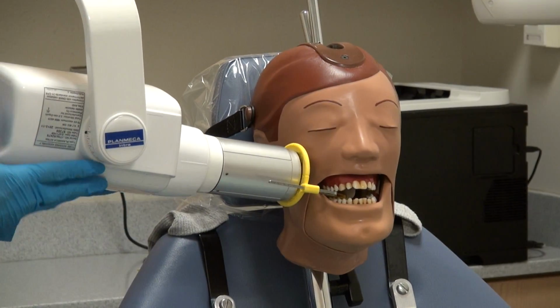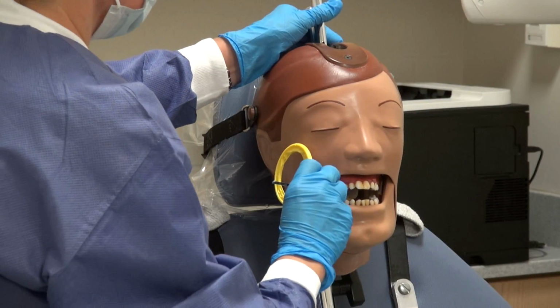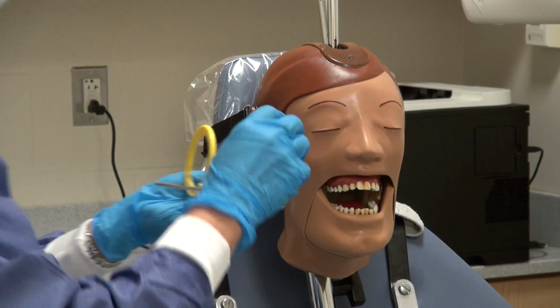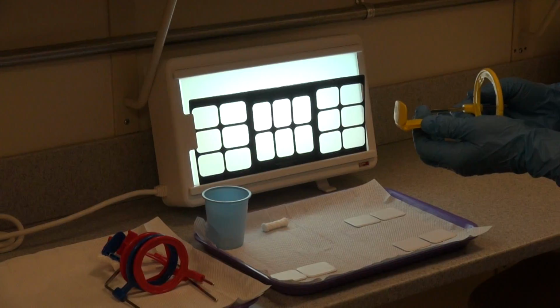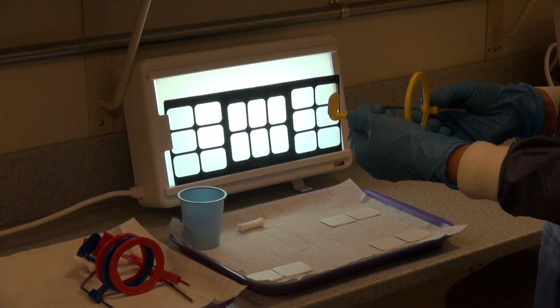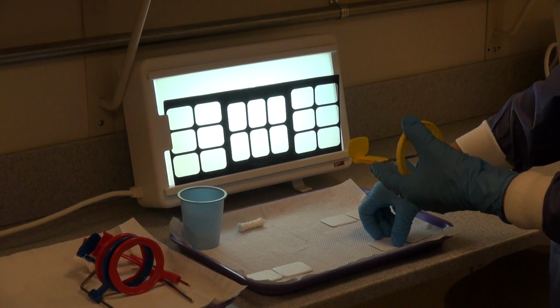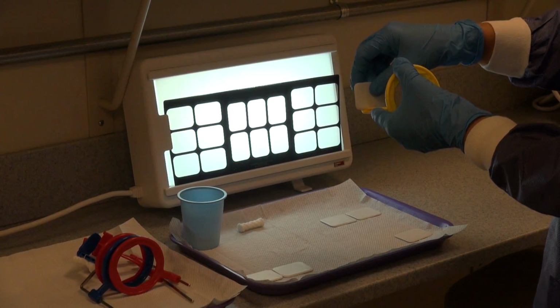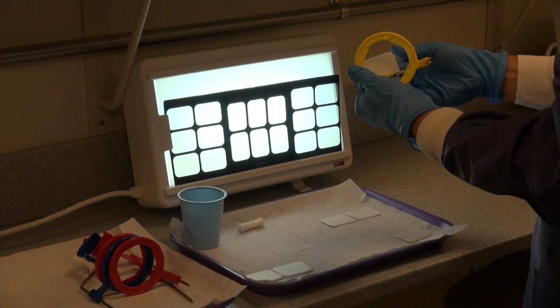Remove the film from the patient's mouth as quickly as possible, and place the exposed film in the disposable cup on the tray. We're going to keep the XCP in the same position for the posterior exposures in the lower left quadrant, starting with the left mandibular premolar periapical. We'll place the film, dot in the slot, and white is right when looking through the ring.